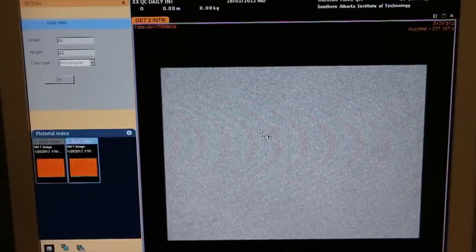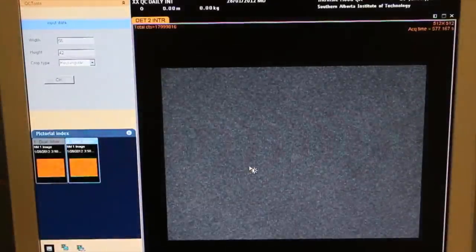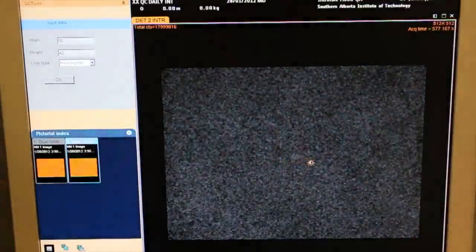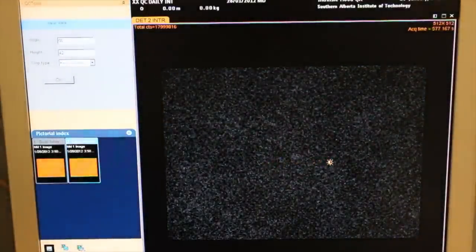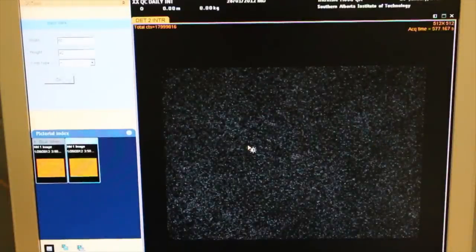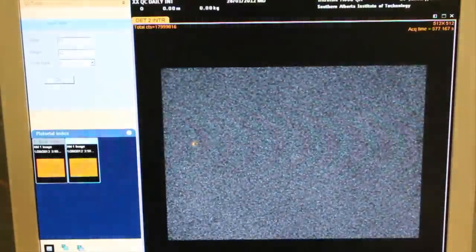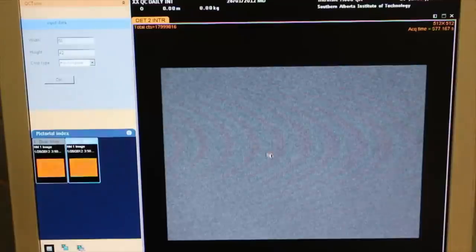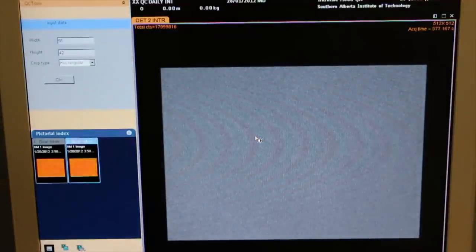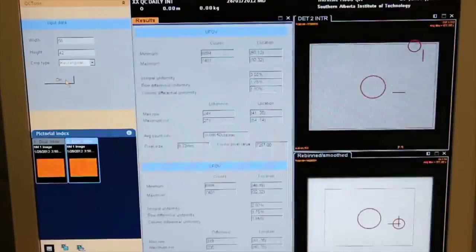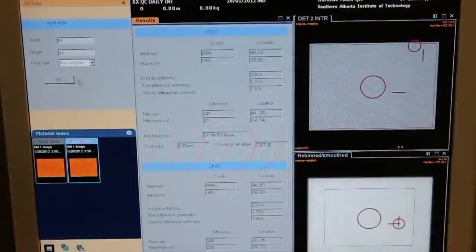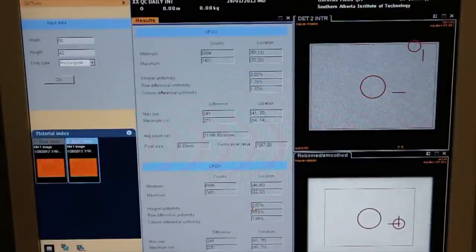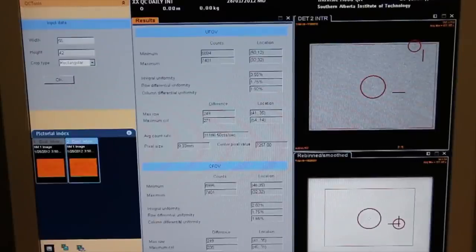Repeat analysis for Detector 2 image. Confirm that the analysis area is correct for Detector 2. Press OK to perform the quantitative analysis for Detector 2.